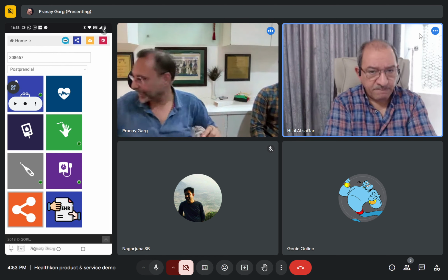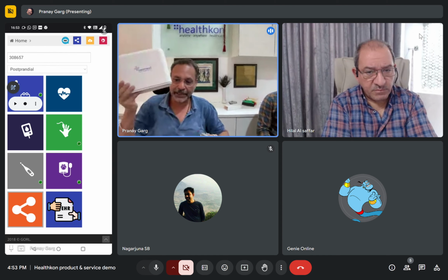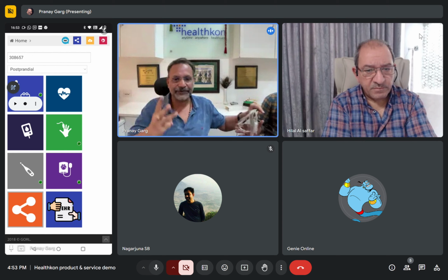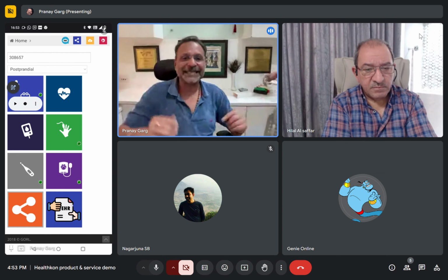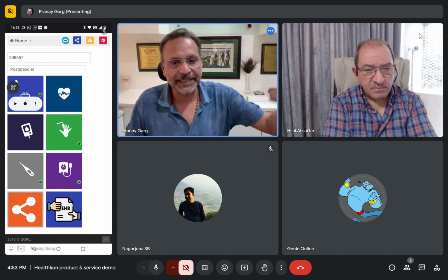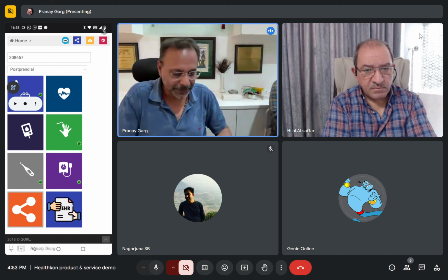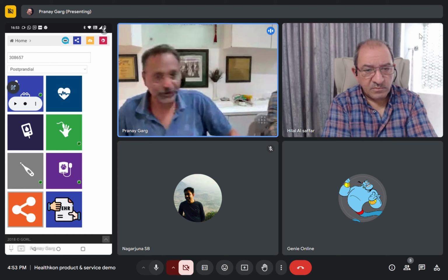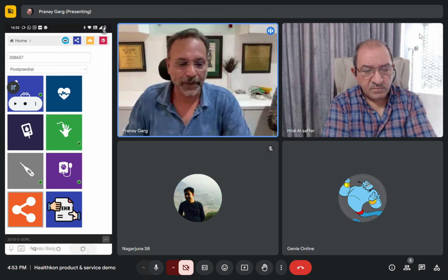Yes. The chest leads will be in the 12-channel continuous monitoring, which I will show you. Here it is just a 3-lead 6-channel. One is Earth. So 3 leads and 6-channel output will be there. Now that we have done with this, the job on this for one individual is over.